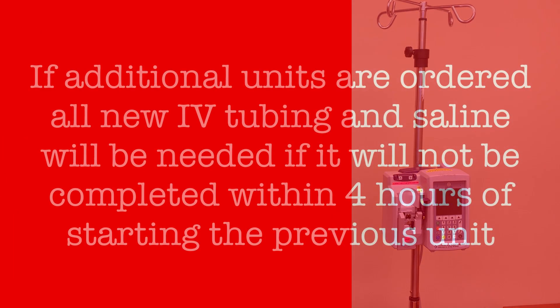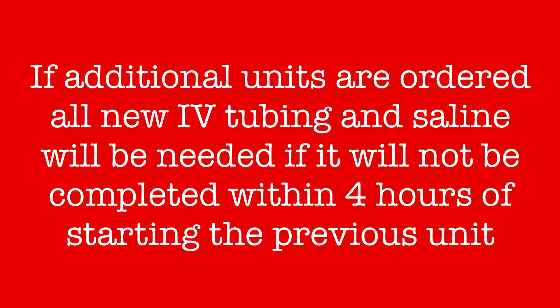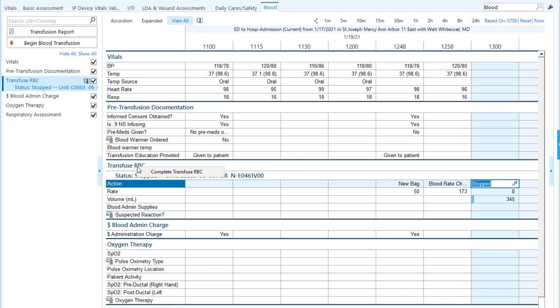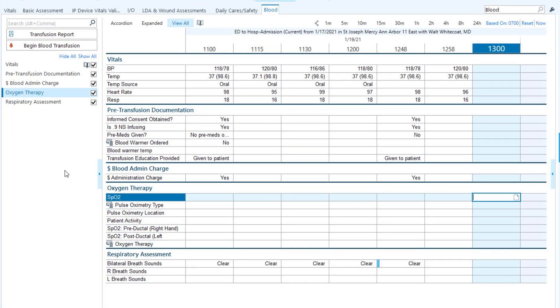If another unit is ordered and it will not be finished within 4 hours of initiating the first unit, a completely new IV set will be required. In EPIC, the blood product will need to be completed — go to the blood flow sheet and enter STOPPED into the action row. Then right-click on TRANSFUSE RBC and click COMPLETE TRANSFUSE RBC. The transfuse section for this flow sheet will be removed.